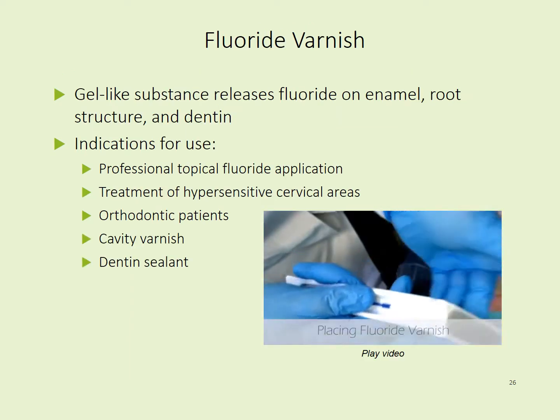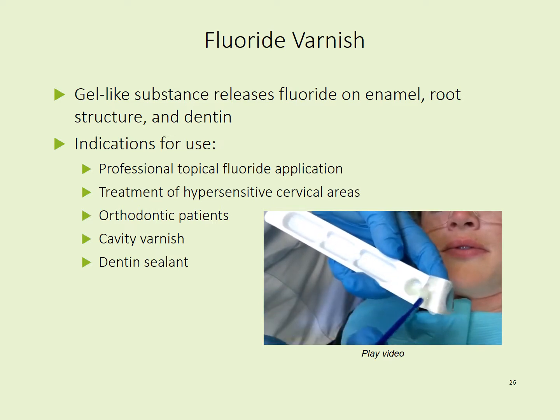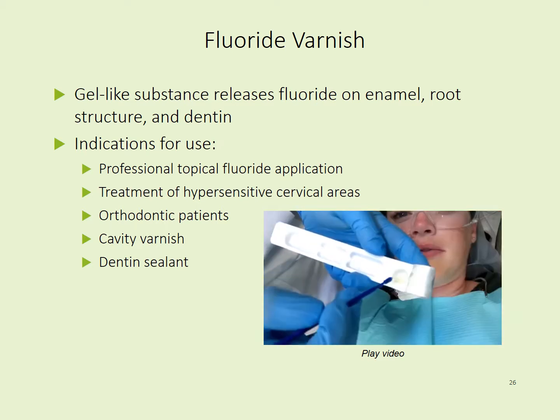To place fluoride varnish, first open the package. These come in all shapes and sizes, but generally they all come with some sort of application brush and the fluoride itself. Make sure you get any extra varnish off the top because a lot of times it separates, so you'll need to make sure that you have a good and even mixture.